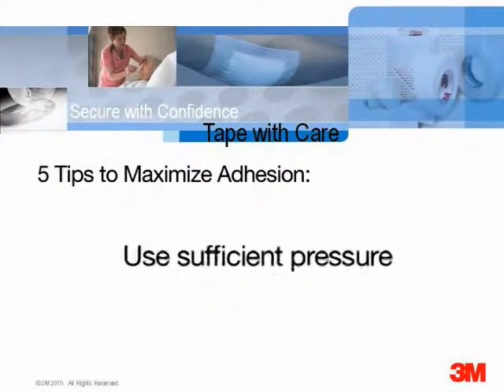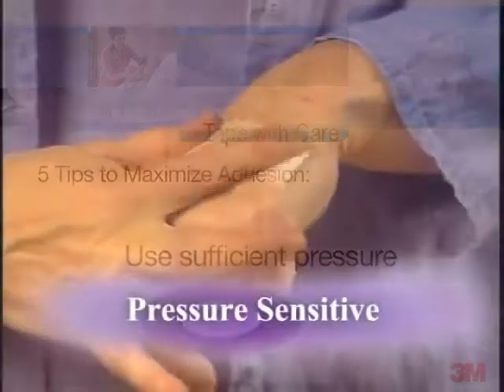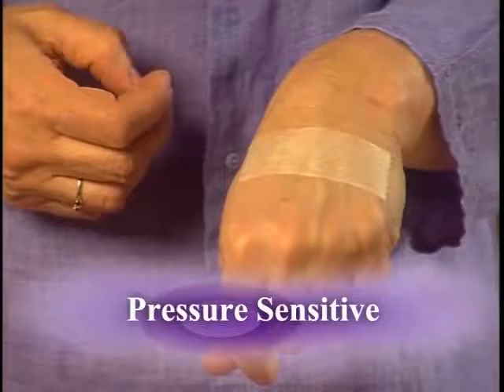Most adhesive medical products have pressure-sensitive adhesives, meaning they are designed to adhere with gentle but firm finger or hand pressure. Apply sufficient pressure to get the adhesive into the nooks and crannies of the skin. Place the tape without tension onto the skin.